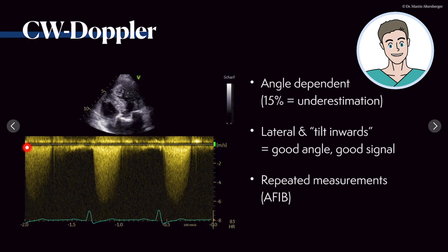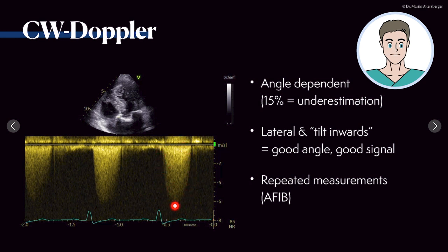In this case we have sinus rhythm. You can see that one signal is a bit weaker compared to the other two. The most optimal signal is probably the third one — it's very dense, and this is what you want in an optimal measurement of continuous wave Doppler of the aortic valve.